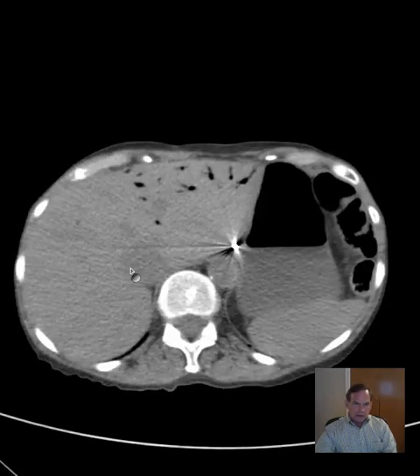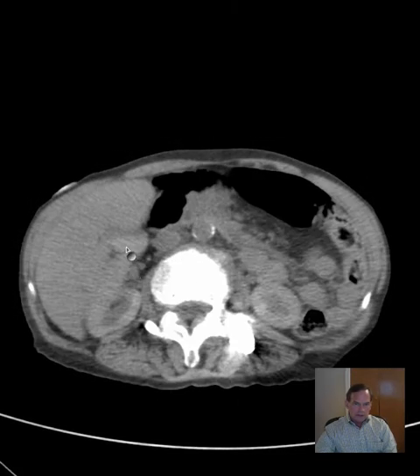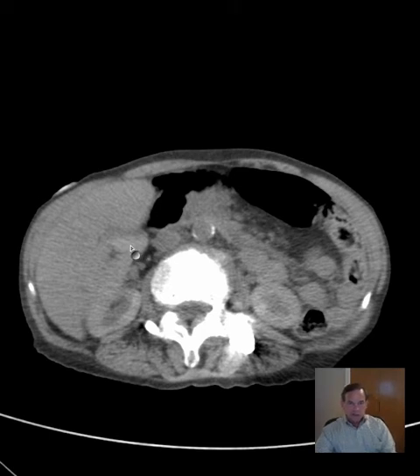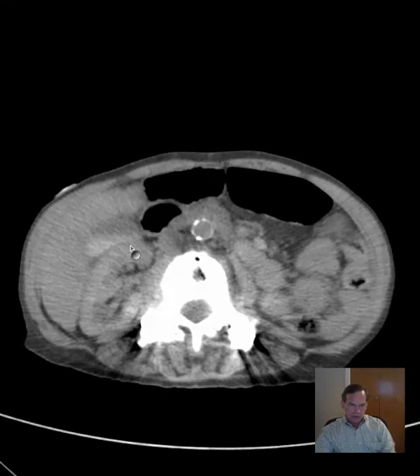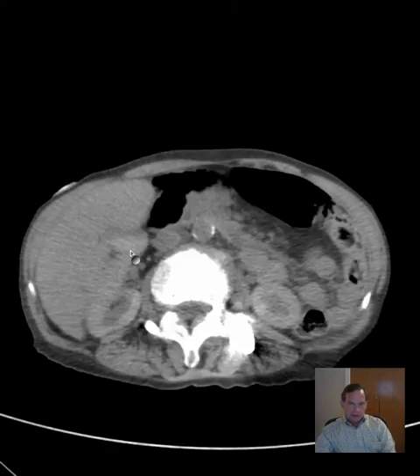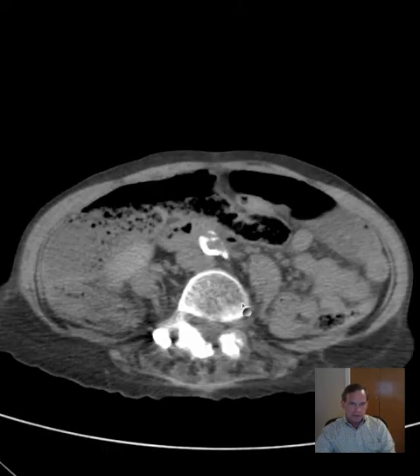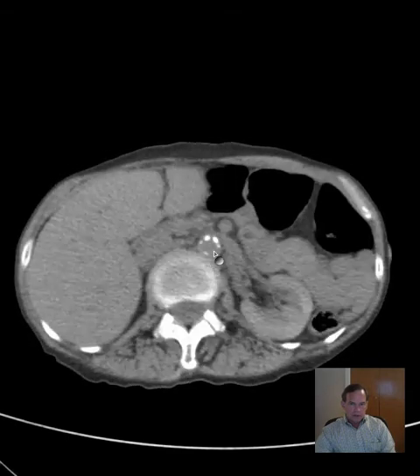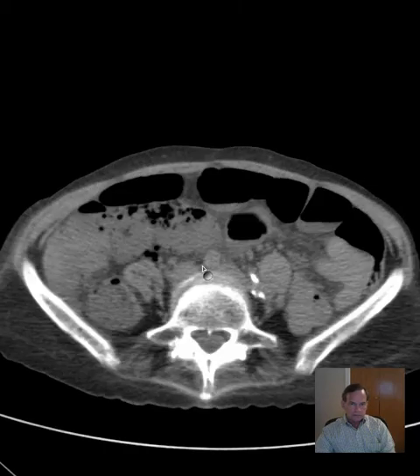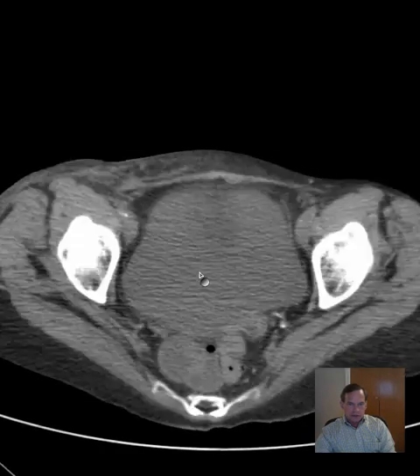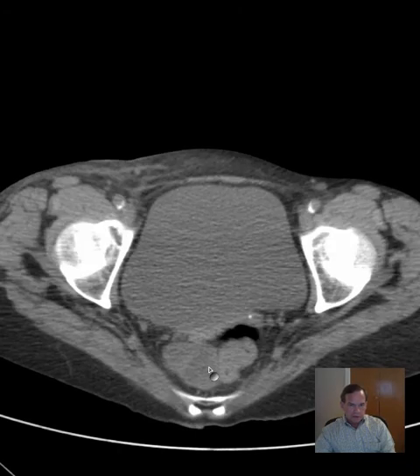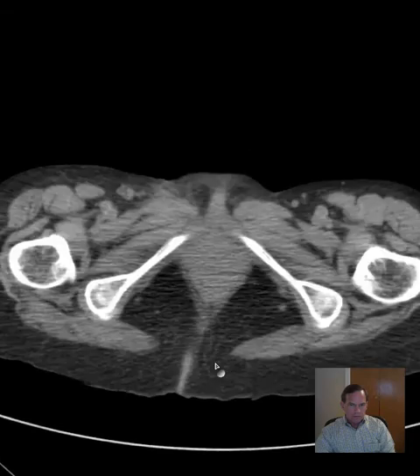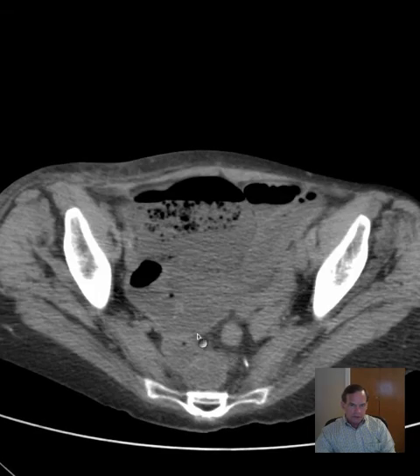The gallbladder — let's see if we see the gallbladder here — has some high attenuation material in it, and that could be stones or sludge. Or if the patient has had a prior IV contrast exposure, once in a while you can get excretion of the contrast in the gallbladder, so that's a possibility there too. Kidneys appear pretty unremarkable — there's the right kidney, here's the left. The abdominal aorta is normal in size. Let's look in the pelvis: is there any free fluid? Here's the urinary bladder, here's the rectum. I don't see any free fluid.